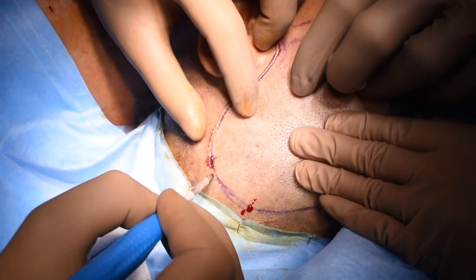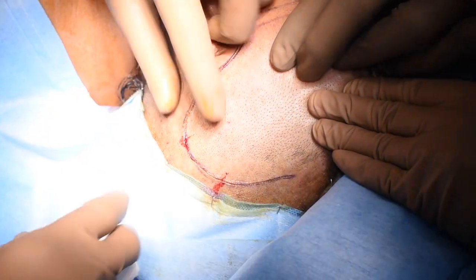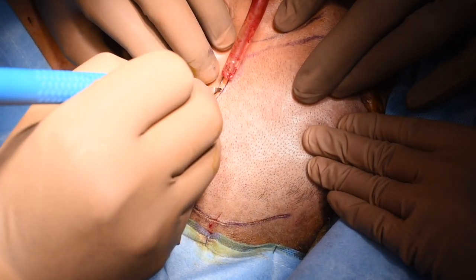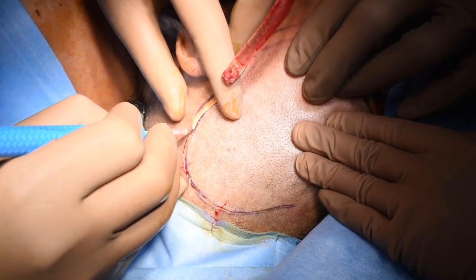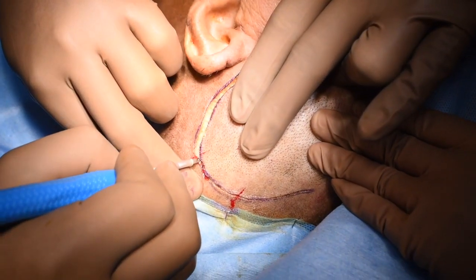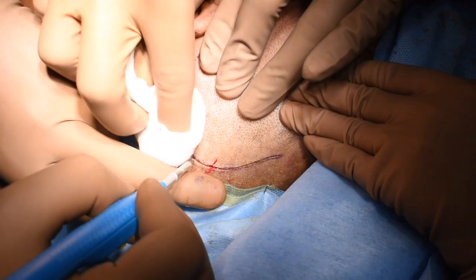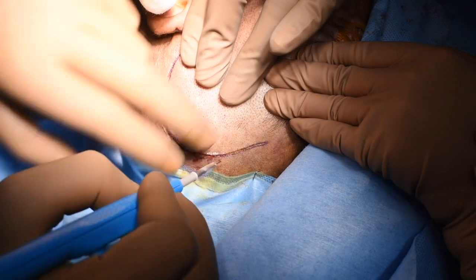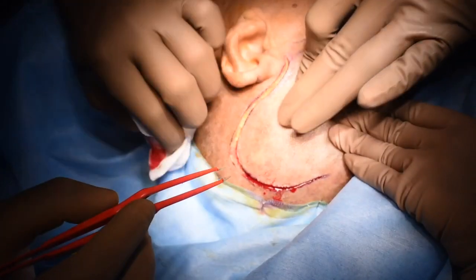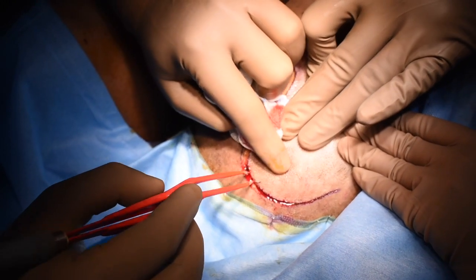The incision begins at the level of zygomatic arch. A monopolar cautery is used to place the incision. The incision is deepened till the temporalis fascia is identified. The temporal incision is confined to the hairline for cosmetic purpose. Profuse bleeding is expected at this stage because of the high vascularity of this area.